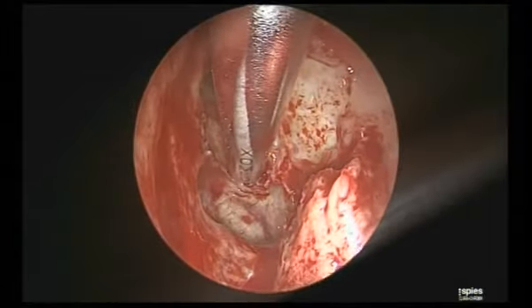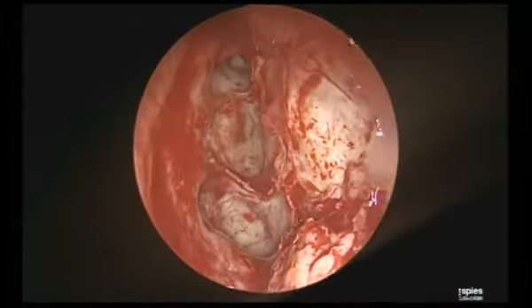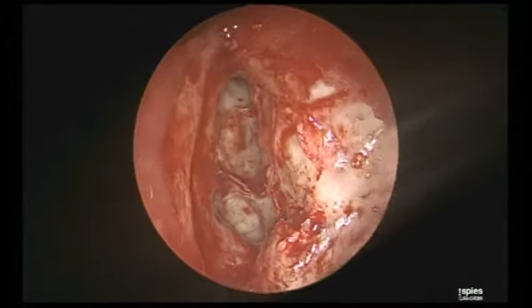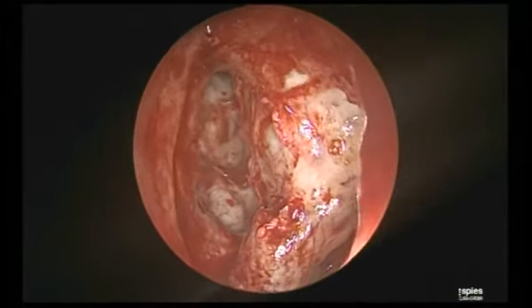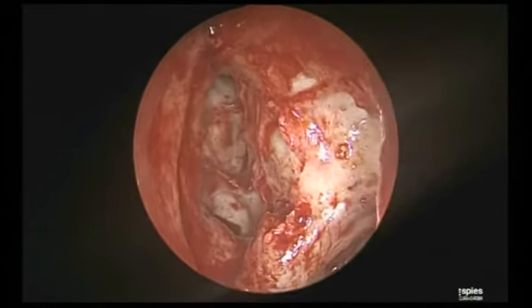Now see your anterior ethmoidal artery completely, your septa completely flushed, and everything mucosalized. So this ends my anterior ethmoidal work. Beautiful, your maxillary.